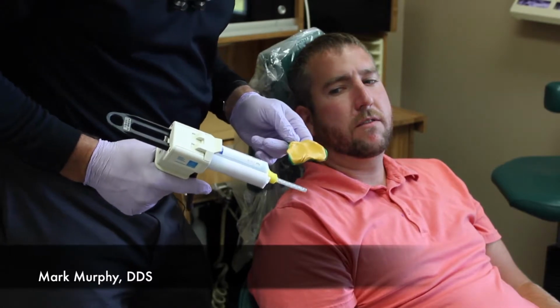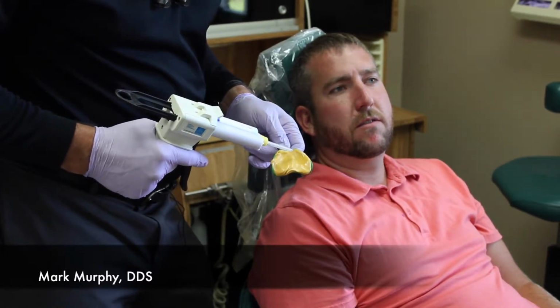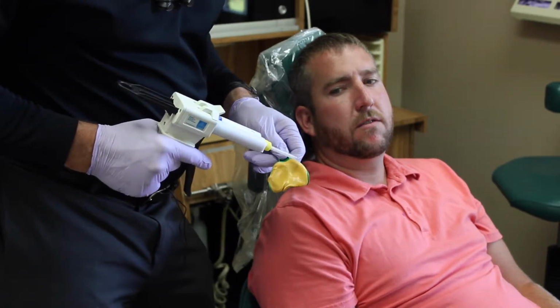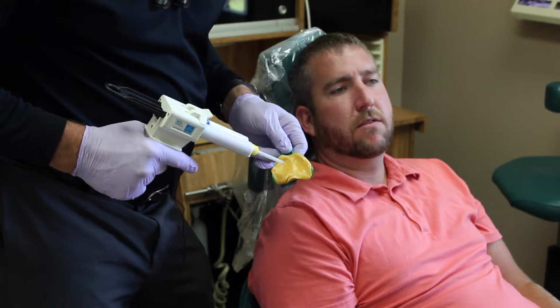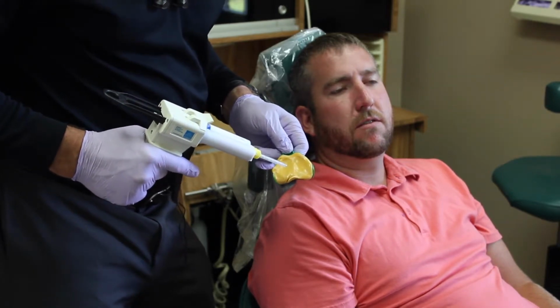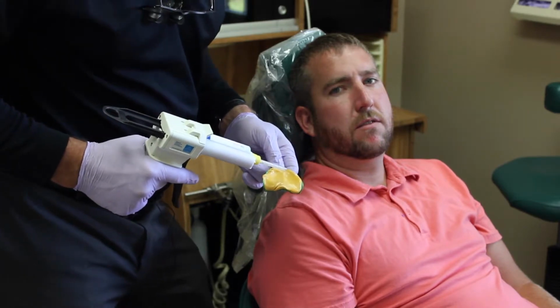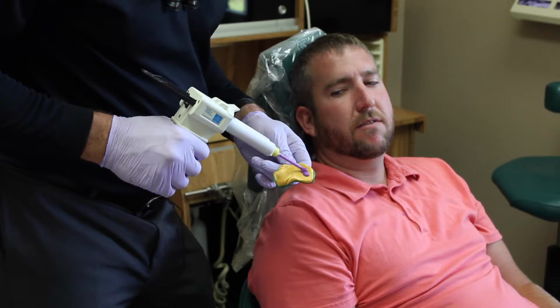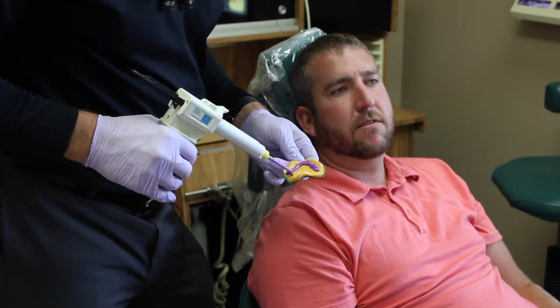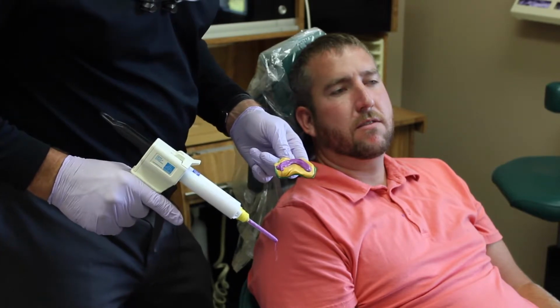This time I'm going to show you two things at the same time. This material, although mixed, isn't mixed 100%. You can see a little bit of some blonde swirls through there, and that creates some inconsistency in the setup and the expansion and contraction of the material. The second thing I'm going to do is try and save some time. If I don't have to do two impressions, and I put the light body on right now, just like I would do the normal full arch impression, I might be able to get away with taking one impression instead of two.